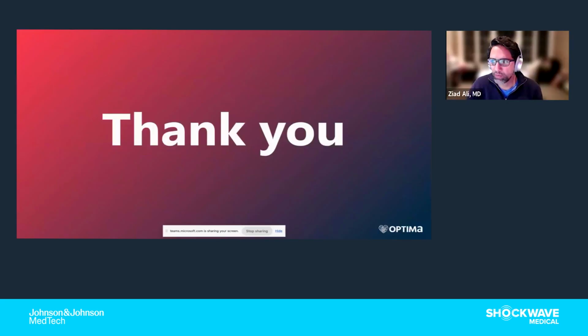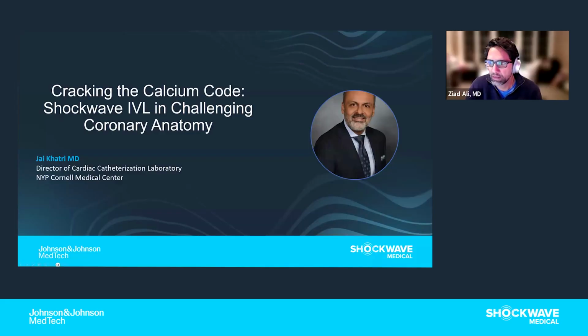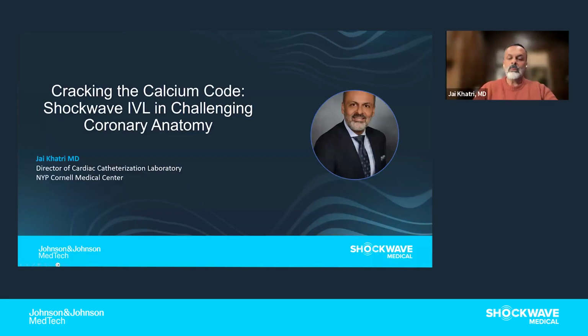Great session. I think there were some really new insights on mechanism of action. Any comments from you guys? I think this whole idea of the shock waves being circumferential is really what's fascinating, because that's an area where there was a lot of discussion about whether this was truly the case or not, or whether the energy was just 180 degrees opposed from the emitters.